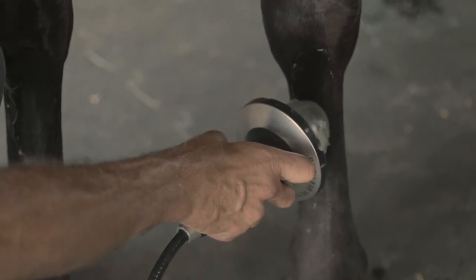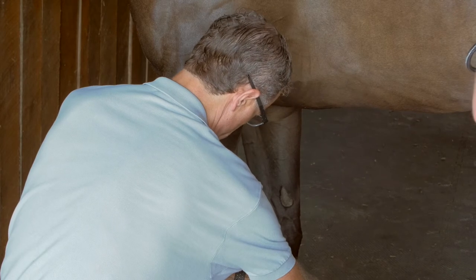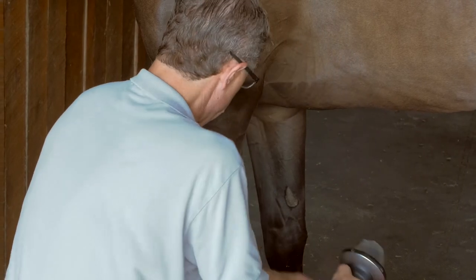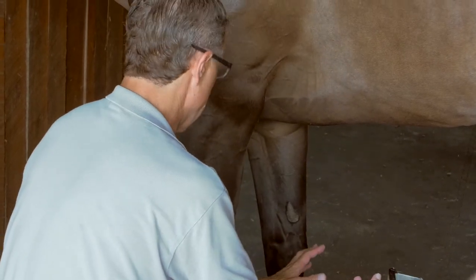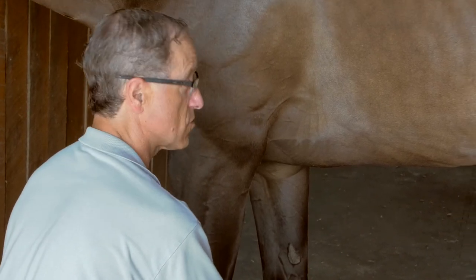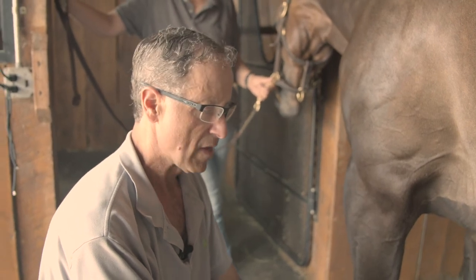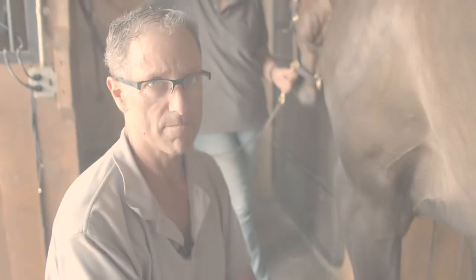This is where the ability to increase the number of shocks is really helpful, because a minimum of 4,000 shocks on each leg is where I believe you get the best results.